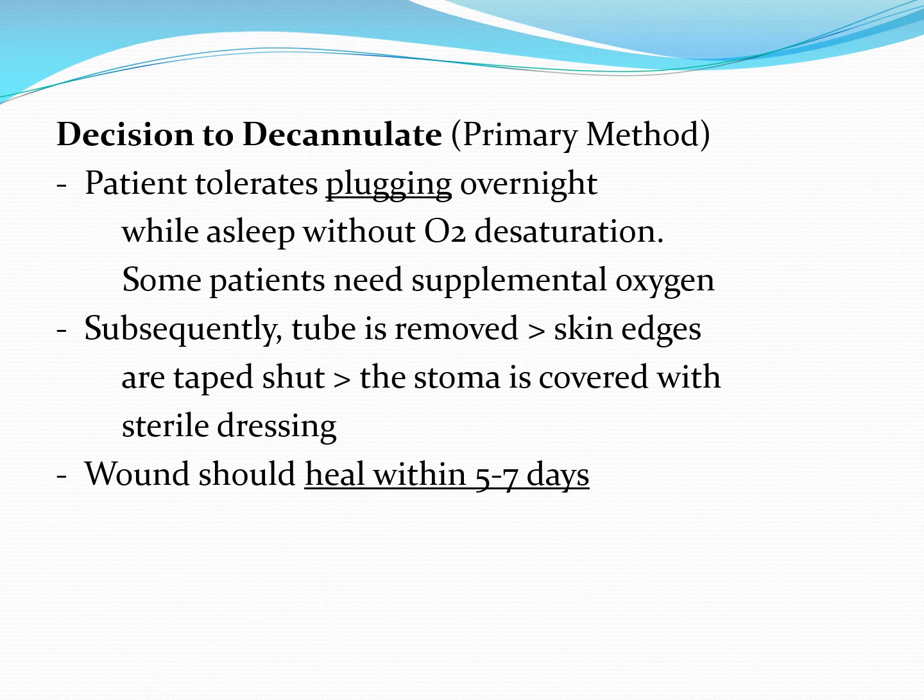Patient, if they tolerate plugging overnight, we're not talking about mucus plugging, we're talking about capping. While they're asleep, monitoring their O2 saturation if they don't have any issues with that. If they do have minor desaturations, provide them with some supplemental oxygen.